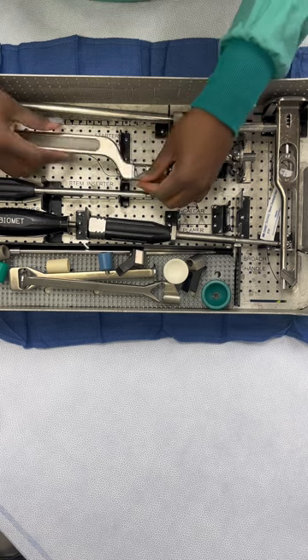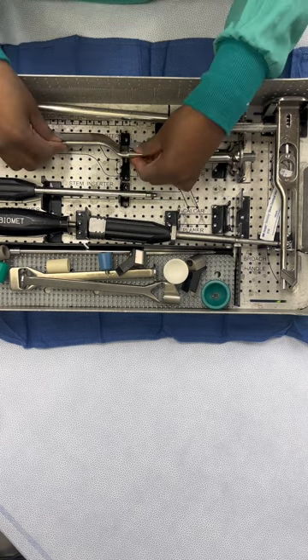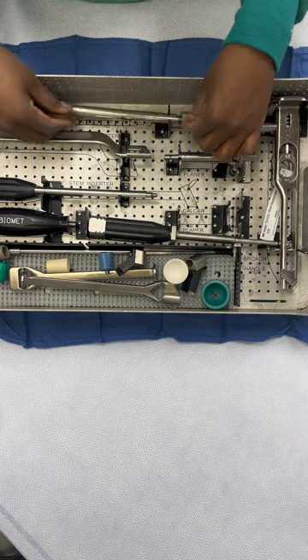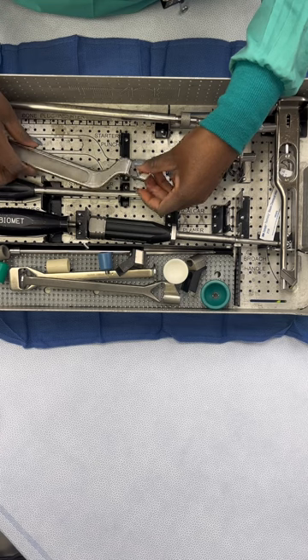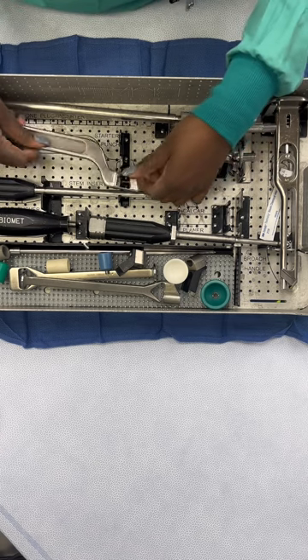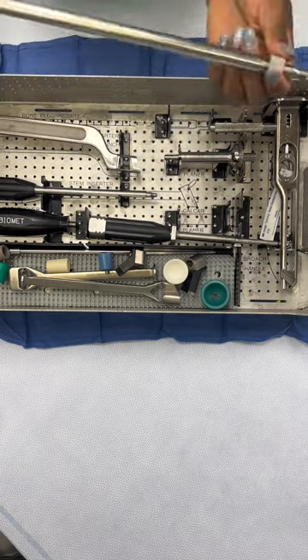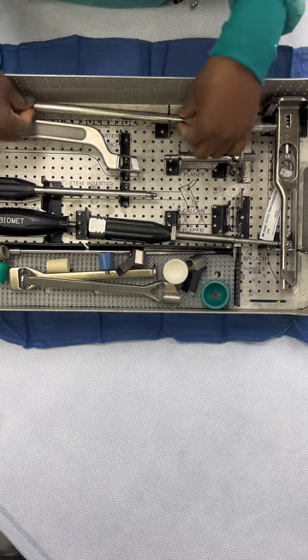Just do your part and then leave the rest. Because imagine this being the first case in the morning and the surgeon opens one of the sets and finds something dirty — oh my god, it's going to mess up the department for that whole day. So just make sure everything is clean.